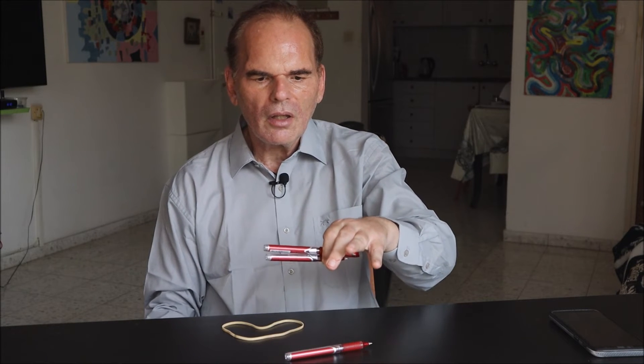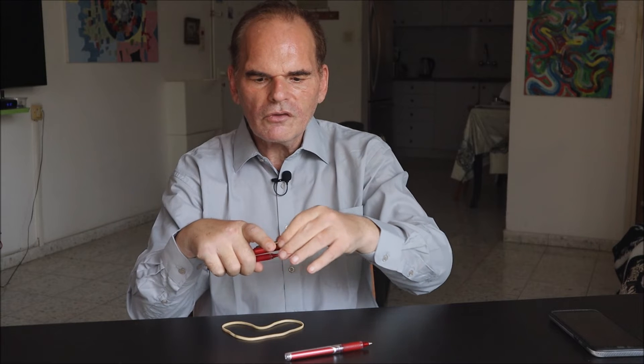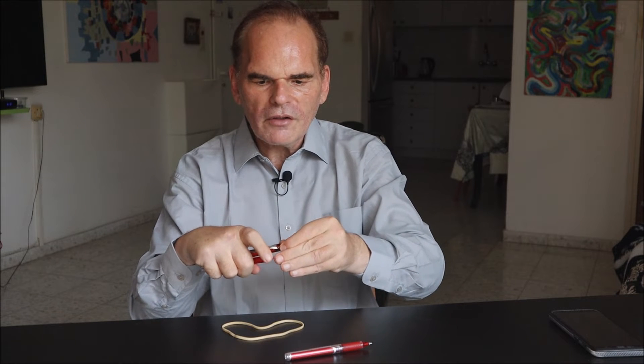And now I will assemble this device. I take two pens and clamp them into the fist of my right hand, and stick out my index finger.